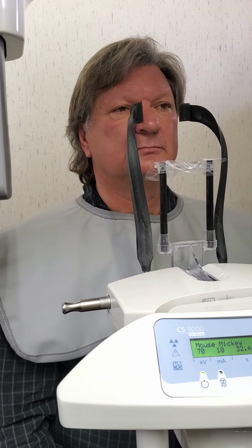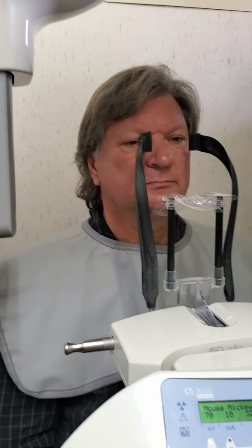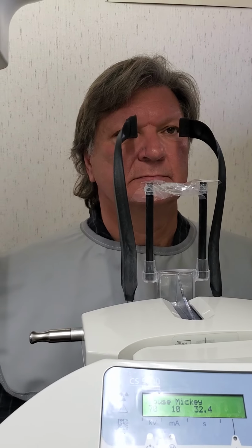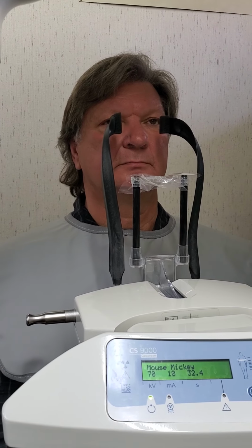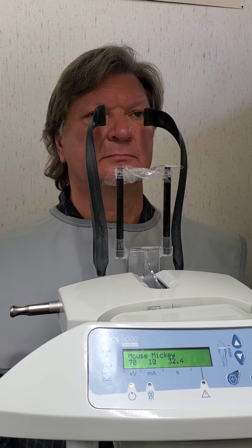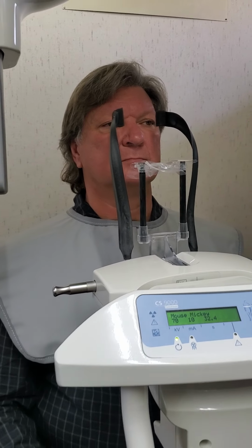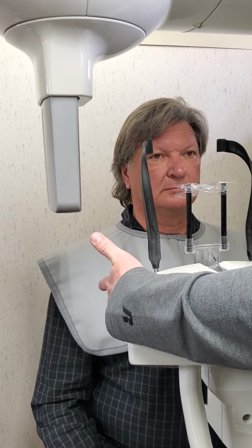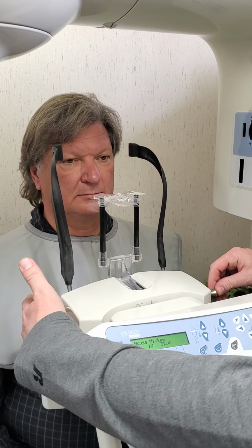So in this case, we're close right now. You see we're close. So we'll have to still position this a little bit higher. What you want to do is have your patient sit up as tall as they can, drop their shoulders down. Okay. Then we're going to press these guys to open the temple rest.